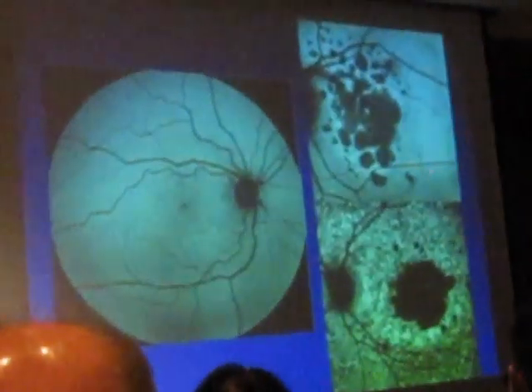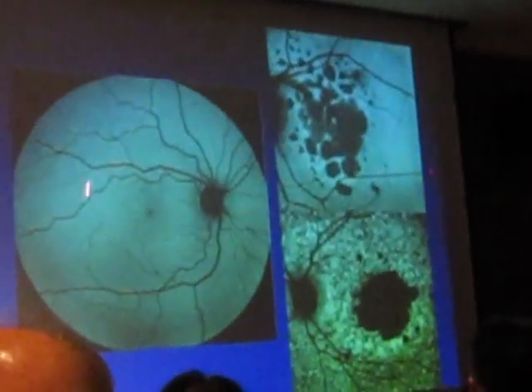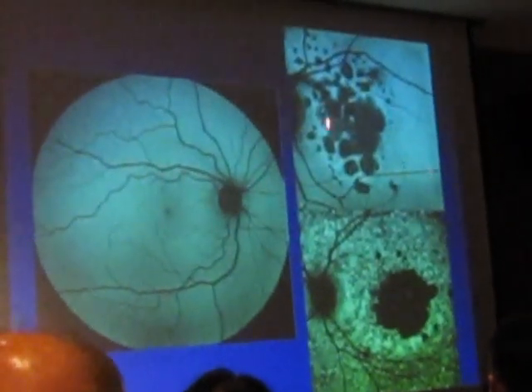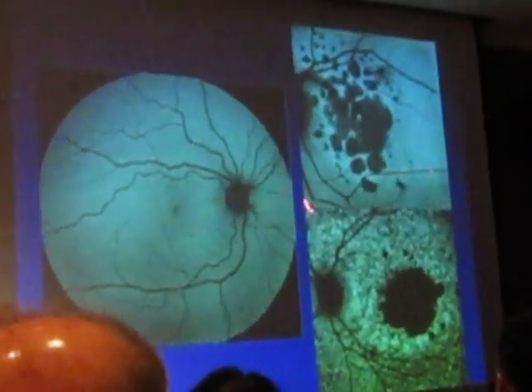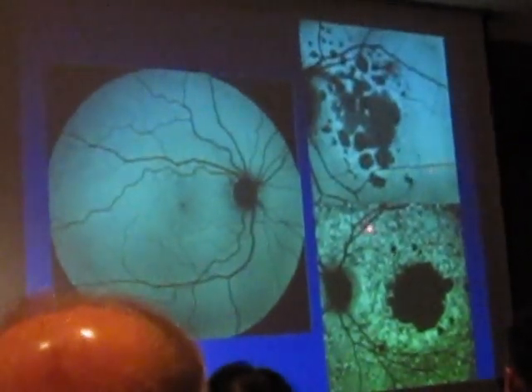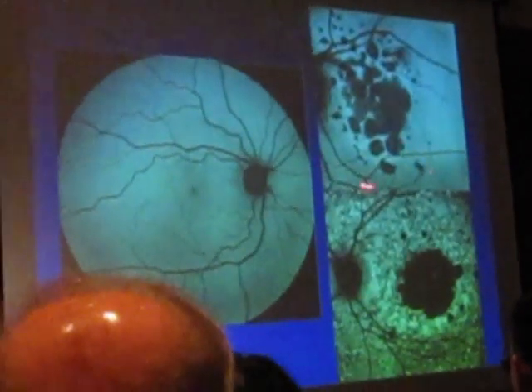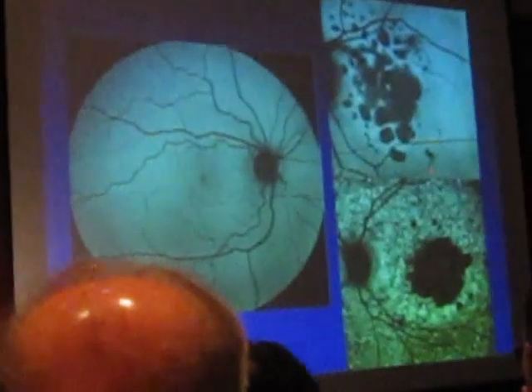Functional imaging. So, normal, AMD, first transplanted AMD, age-related macular degeneration patient, autofluorescence image. Stargardt's, first Stargardt's. So, very compromised, the whole back of the eye, missing, pretty compromised here, missing.